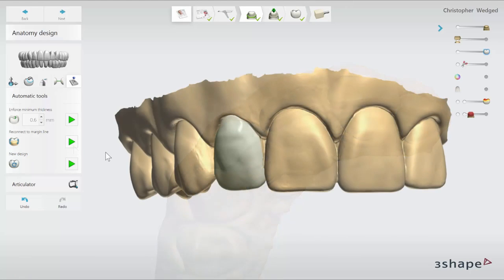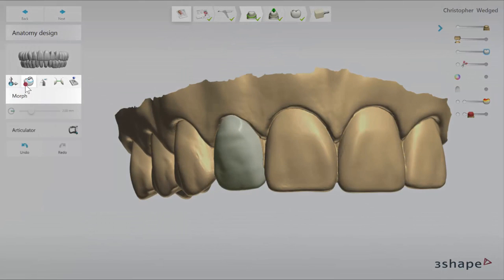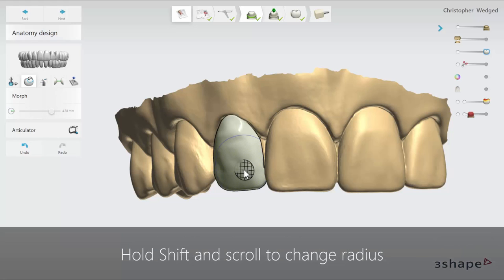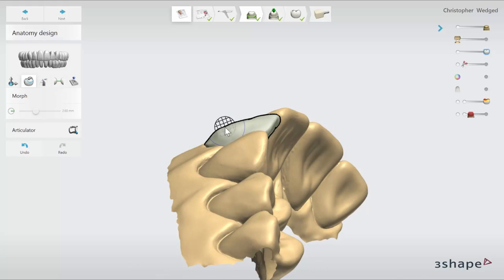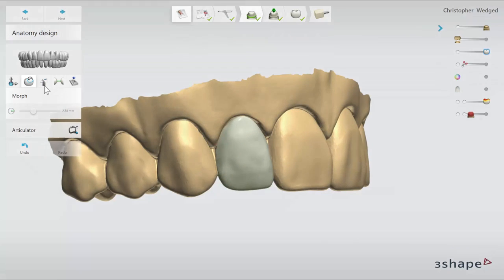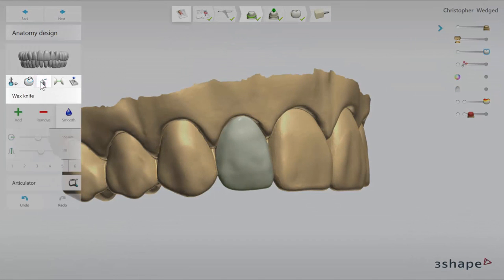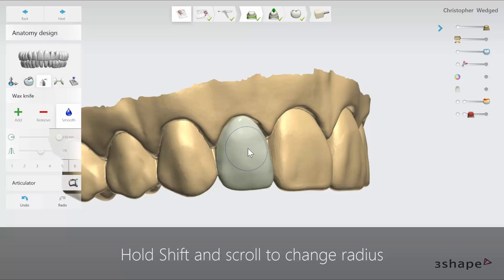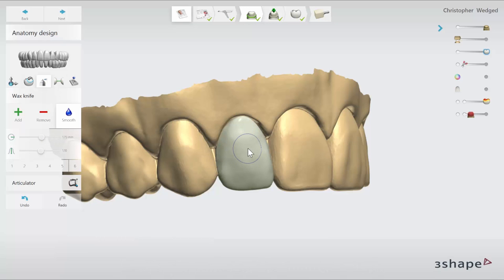Then use the other design tools to adjust the design. Use the morph tool to apply changes to different surfaces. Click shift and mouse scroll to change the radius of a tool, then click on a chosen point on the tooth and drag to make changes. Next use the wax knife to add and remove material from the design as well as to smooth it.